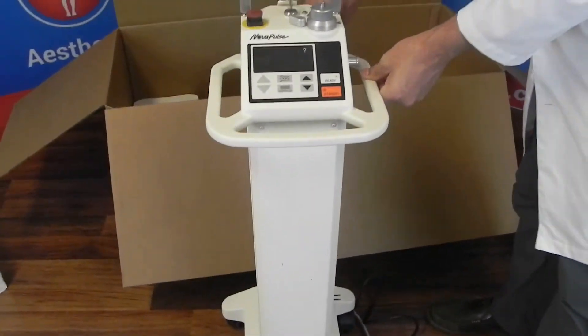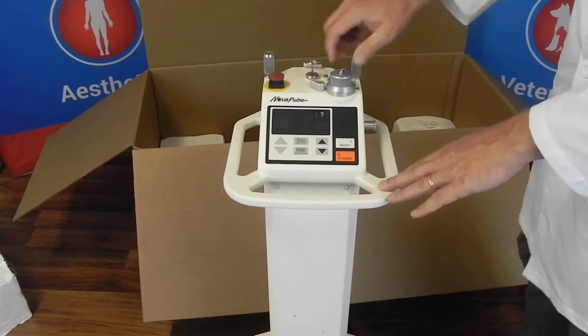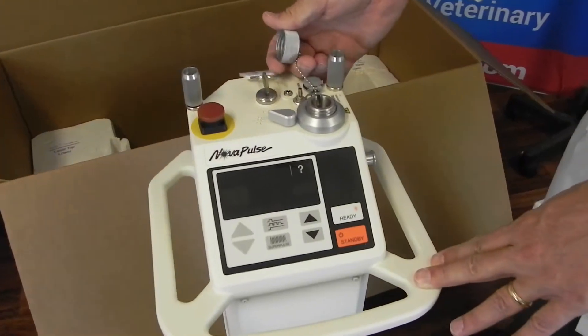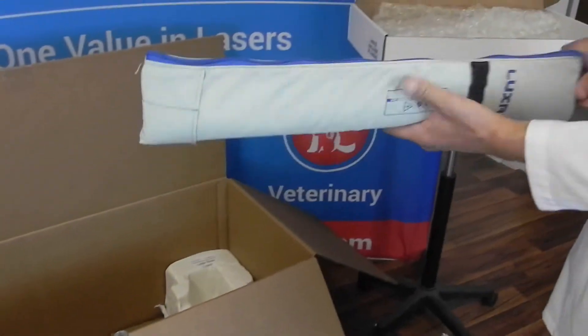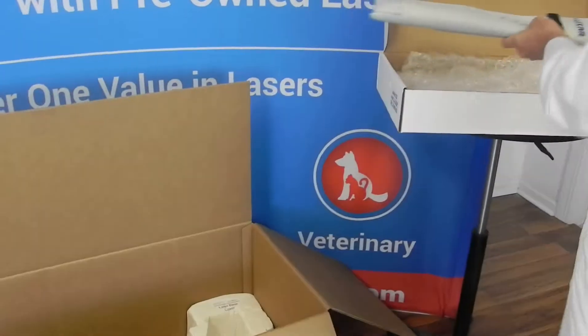So now what you have to do — if the key's not in there, go ahead and put the key in. Open up the dust cover for the mast, or some people call it the turret. Inside your accessory box will be the turret in a foam padded bag.